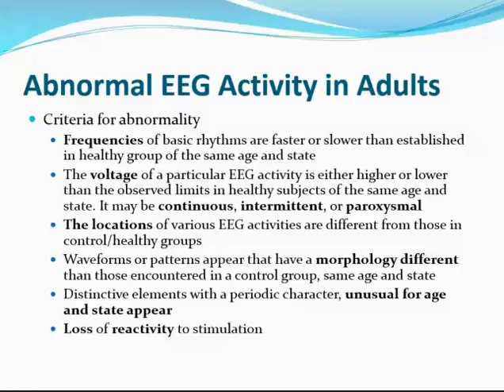Up to now, we've spoken about what happens in a normal, healthy adult, with their frequencies for certain locations of the electrode and on which hemisphere, and what happens if there is any stimulation. Now, if what is expected is not seen, then we know there's an abnormality. This is assuming that technically we are sound, and we have placed everything the way it's supposed to go.